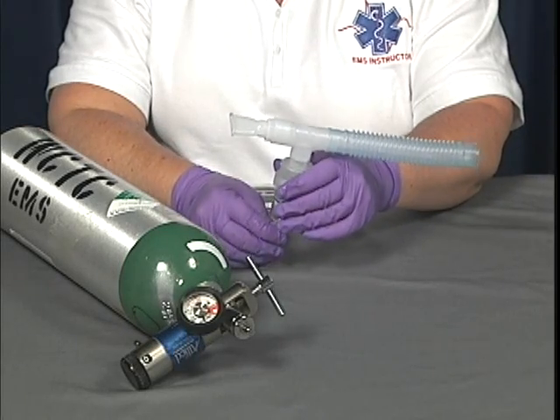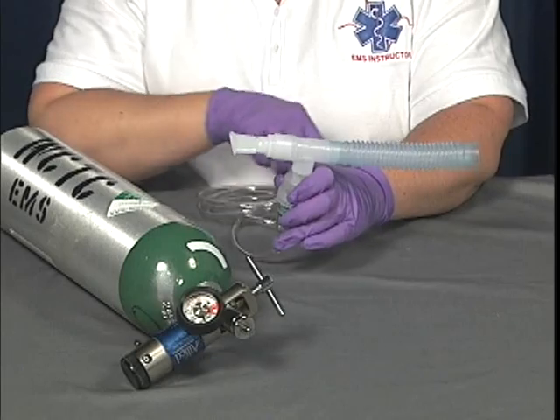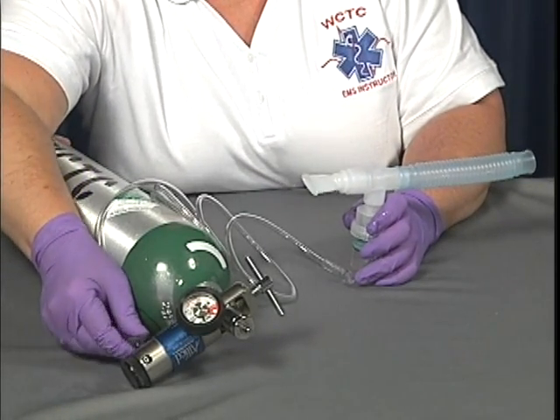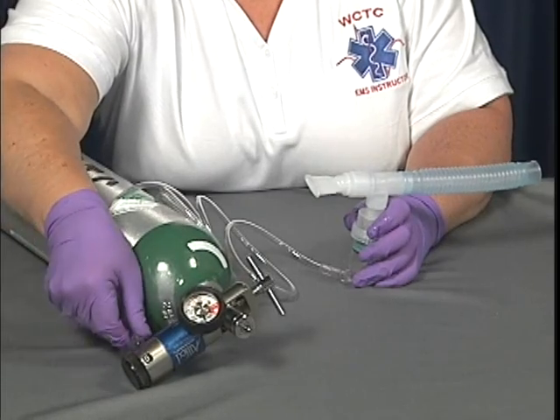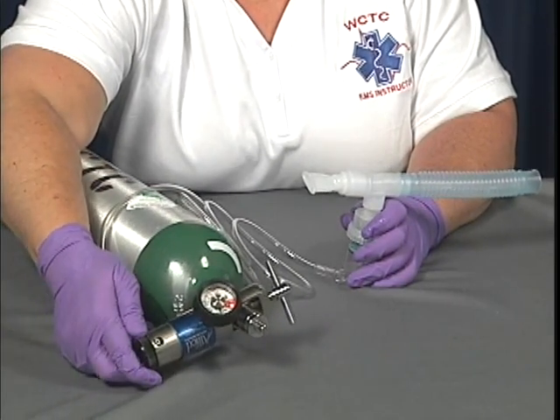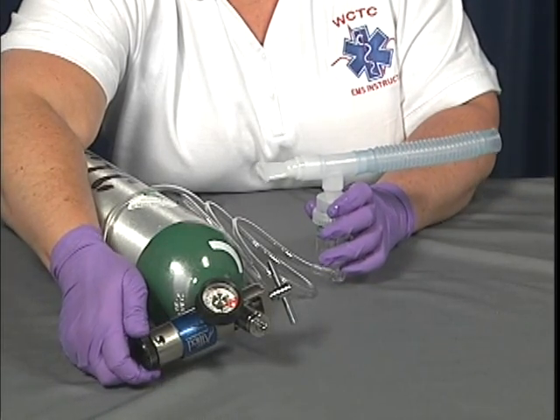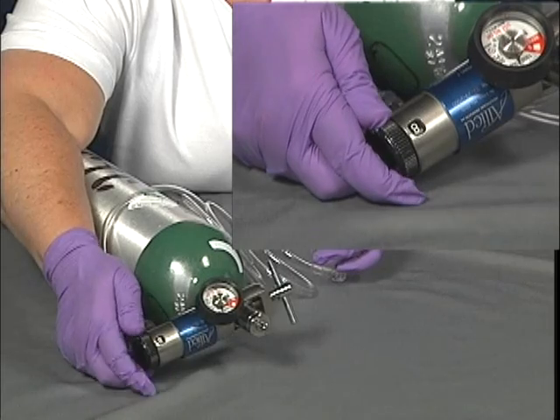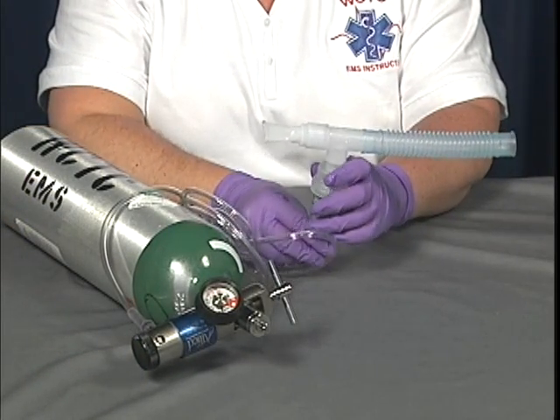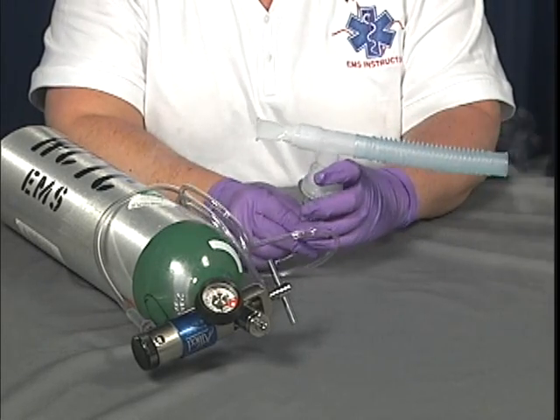Attach the oxygen tubing to the inlet port of the medication cup. Attach the other end of the oxygen tubing to a source capable of delivering 6 to 8 liters per minute of oxygen flow. Turn the oxygen on and adjust the flow for best results. If there's a problem and you don't see mist coming from both ends of the nebulizer, recheck all your connections and flow rate.